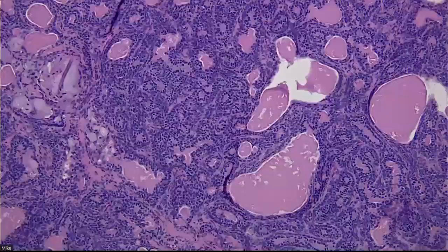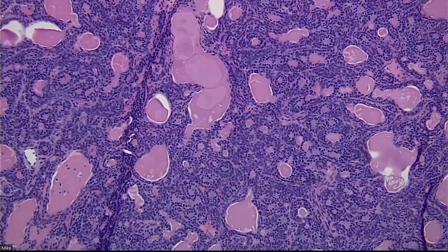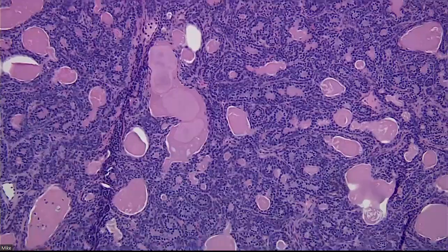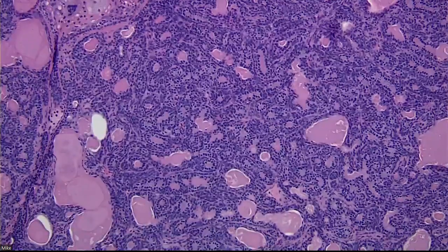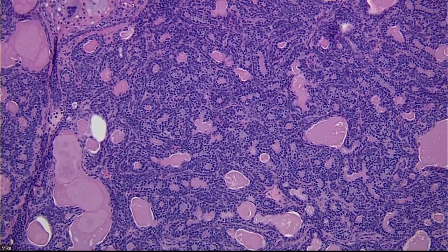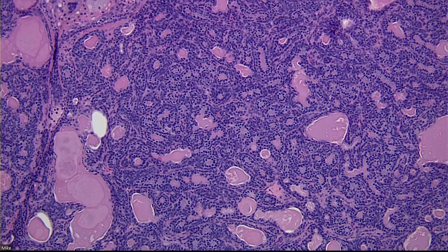Because why? Okay, can you have such a thing as a benign neoplasm? This is benign. Okay, so like benign. Maybe we need to review what hyperplasia versus neoplasia is. Do you think this is a tumor? Yeah. So how is a neoplasm different from a tumor?